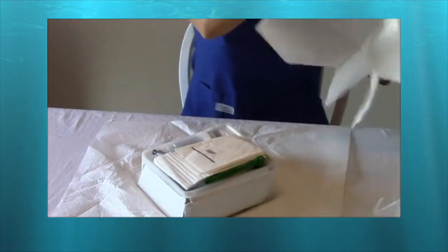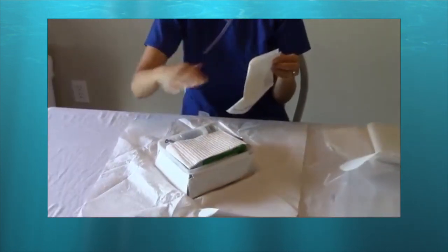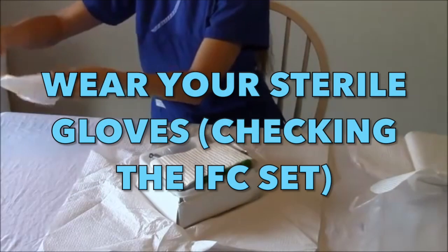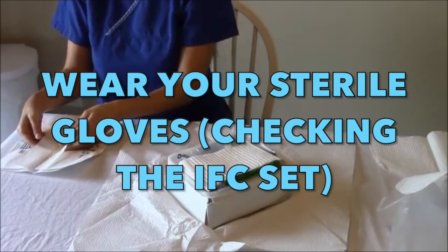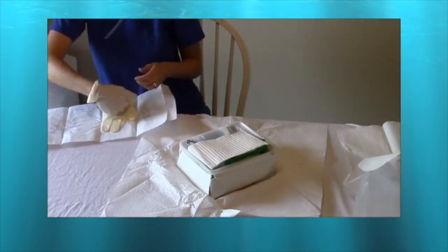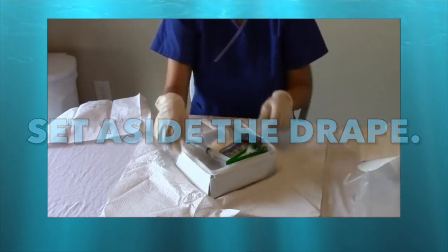We will use the drape to expose only the area needed for insertion. There are also sterile gloves here that we are going to use during the insertion — do not forget to maintain sterility at all times. We are not yet inserting the foley catheter; first we need to check the foley catheter set to make sure there are no problems, and please ensure you are wearing the right size gloves.